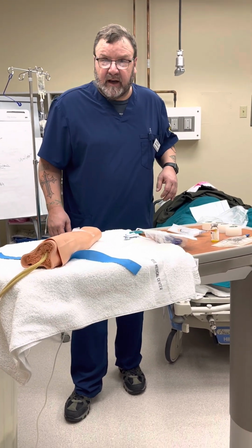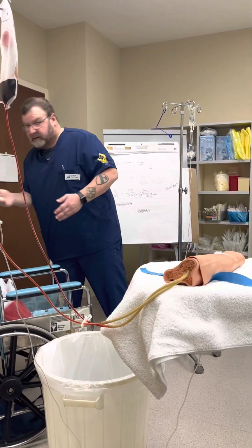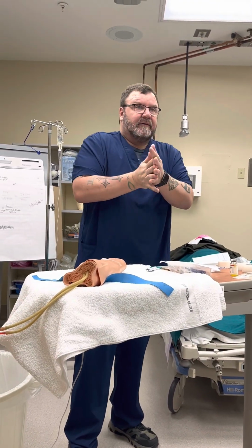So I'm back to do a piggyback with my patient, and I'll do some hand hygiene. Wow, softly humming, won't you be my neighbor? I will get ready for this piggyback.